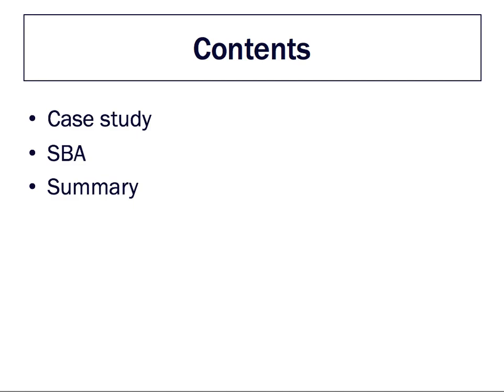Because malignancy is a very broad term, I'll be approaching this by using a case study to demonstrate when and why CT is used for malignancies. I'll then give you a bit of a challenging question where you can have a go assessing a CT yourself and coming up with a diagnosis, and then we'll quickly summarise everything at the end. So, straight into it with the case study.